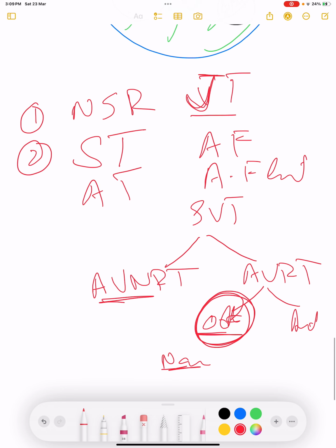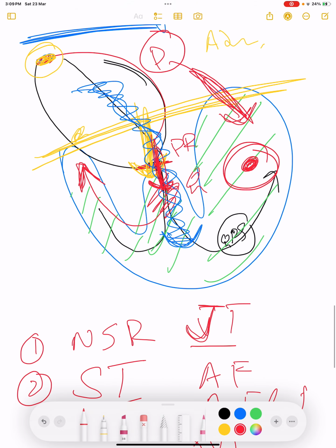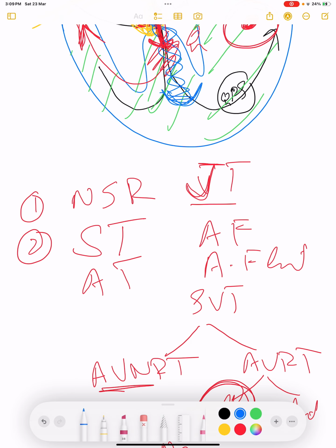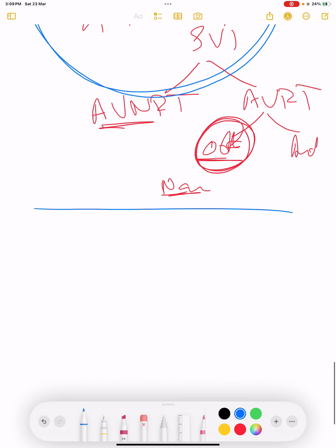Junctional rhythm, junctional tachycardia, SVT, normal sinus rhythm, sinus tachycardia, atrial flutter, atrial fibrillation, all these rhythms will be narrow complex rhythm or narrow complex tachycardia, and the QRS complex will be narrow because these abnormalities or normalities are above the level of the AV node. If it is above the level of the AV node, QRS will not be affected. Okay, so now let's read about broad QRS complex.